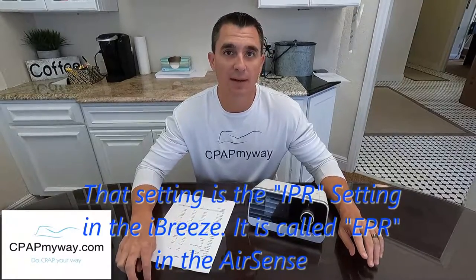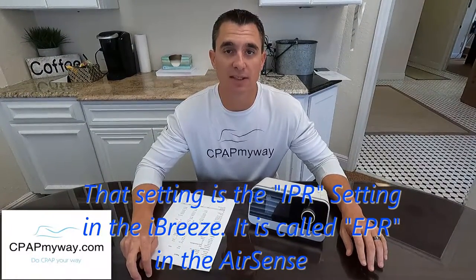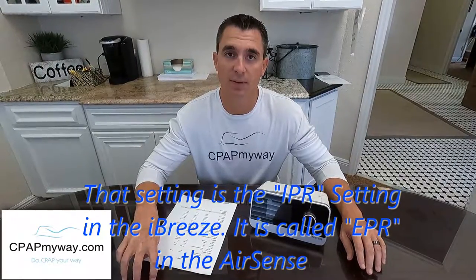All right, so the demo went well. I would say 8.5 hours of uninterrupted sleep is certainly a good start for a machine like this. The two things I would point out: we did have to decrease her exhalation setting from a 3 to a 1 compared to her AirSense 10. I'm sure there are some differences in the algorithm that make it feel a little different for the user. So you could play around with those settings if you feel there's a little bit of an exhalation issue.